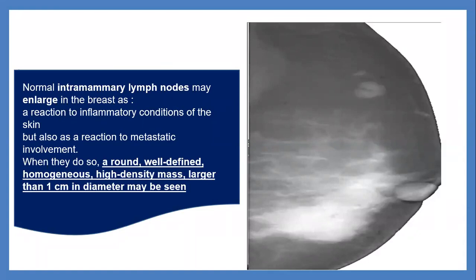Yes, increasing in size on follow-up. Become rounded. Losing the fatty hilum. Okay. What else?